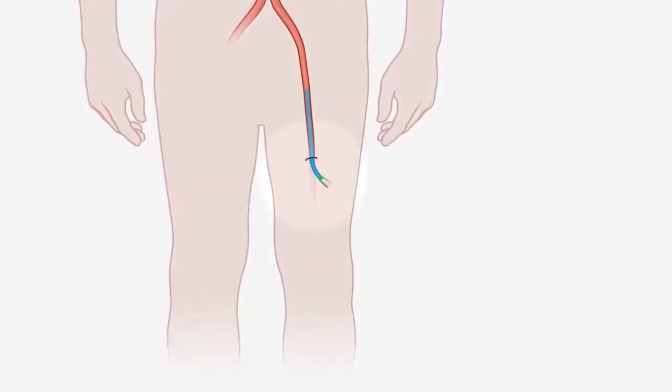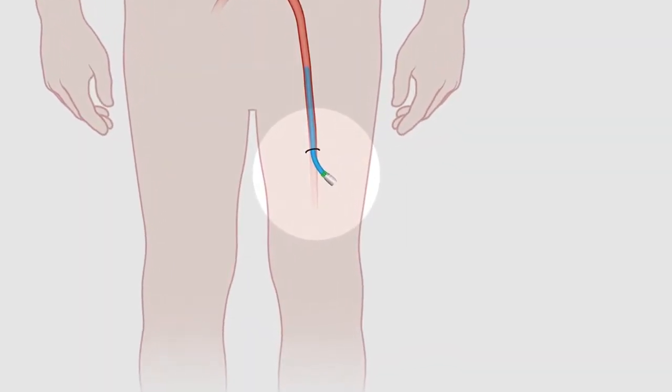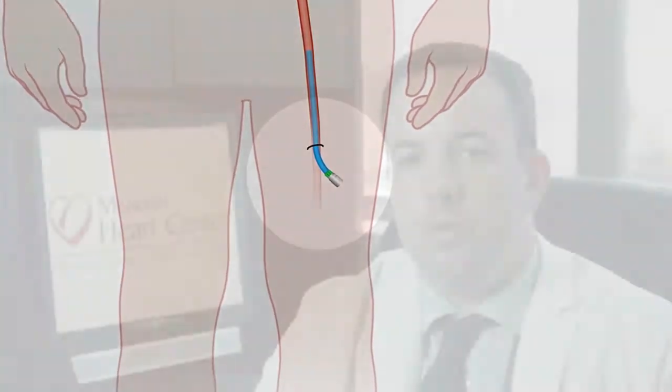In high-risk patients, TAVR is as safe or safer than surgery, but it's still an invasive procedure and there are associated complications, although they're rare. The most common complication is related to access, as we try to pass the stent and balloon into the iliac system or the leg arteries, trying to get to the heart. There can be some damage to those vessels, and those need to be addressed.